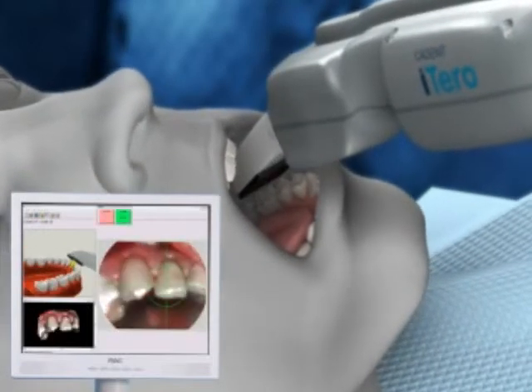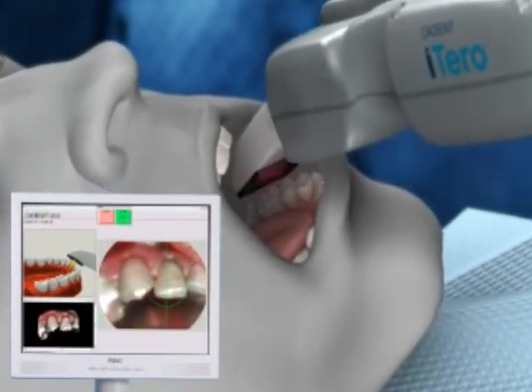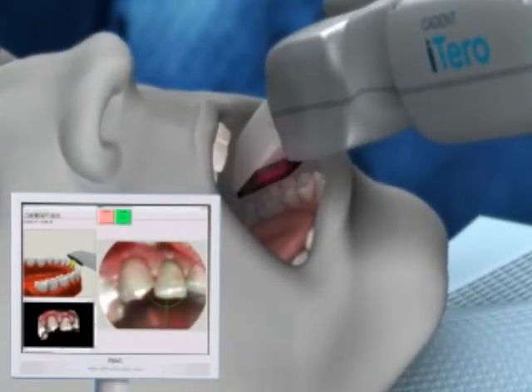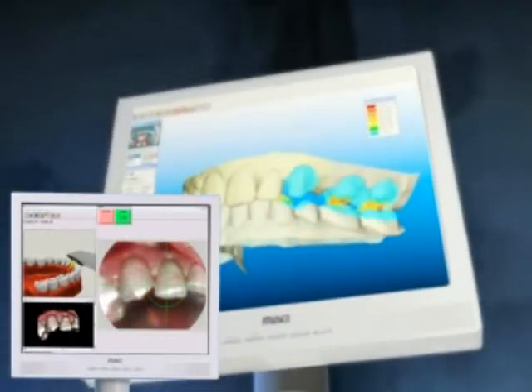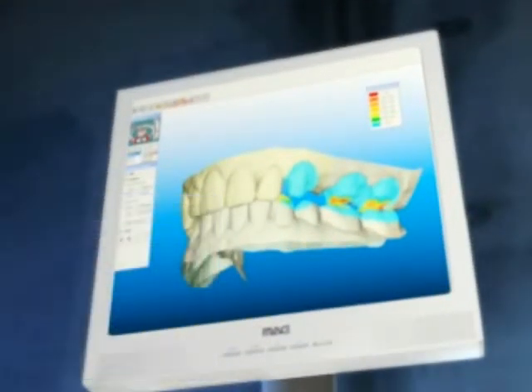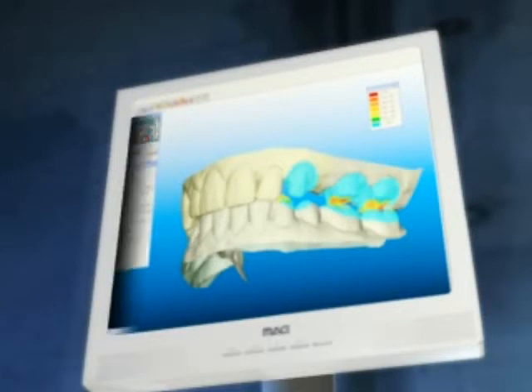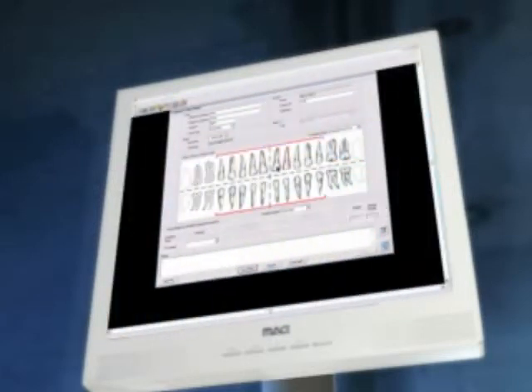iTero guides the user through each step of the scanning process. Its chair-side visual display enables the clinician to view digital images of tooth preparations and occlusal clearances for correction and confirmation of preparation design.